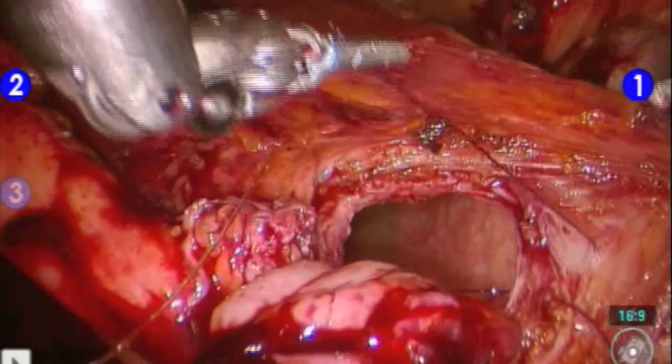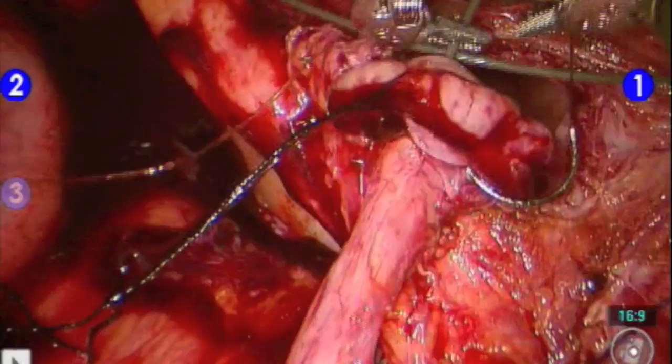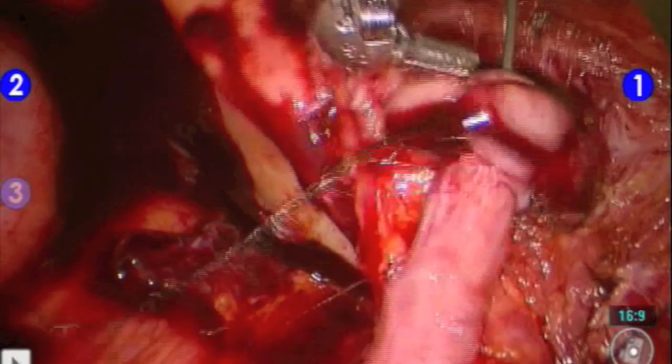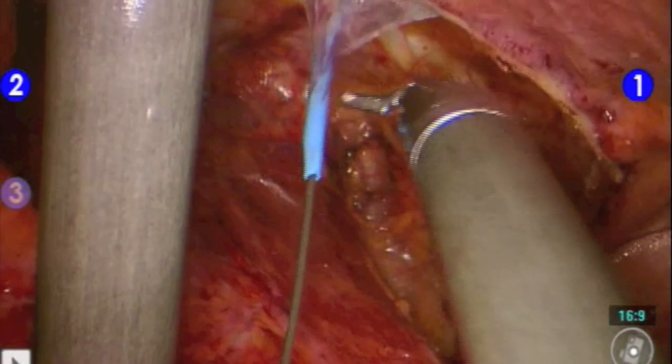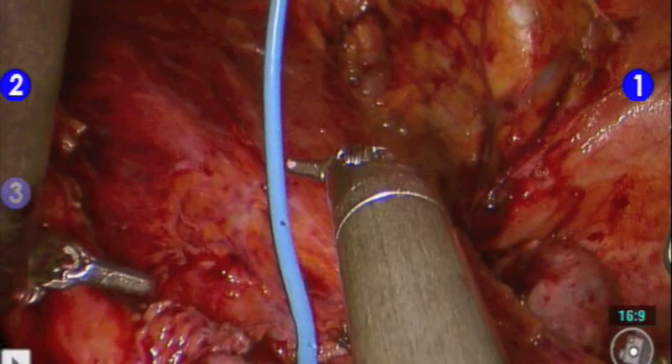This is done by passing a 14 French angiocath needle into the anterior abdominal wall, through which a glide wire is passed. The glide wire is then grasped by the robotic surgeon and passed into the ureter up to the level of the kidney. The ureteral stent is then passed through the anterior abdominal wall through the same stab incision, passed over the wire up to the kidney. When it is finally up at the kidney, the wire is removed and the distal curl is then placed into the bladder.